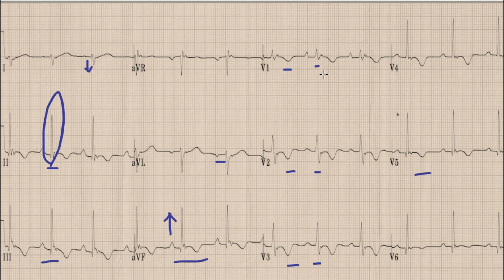This hump or prominence in lead V1 is called an epsilon wave. Another important finding is the delayed upslurring of the S wave in lead V1. The upslurring means that the terminal portion of the S wave in lead V1 is slurred.